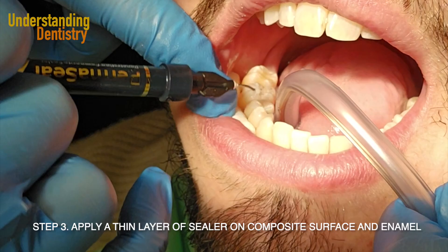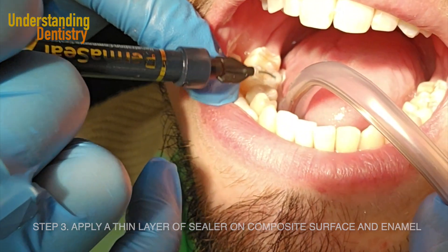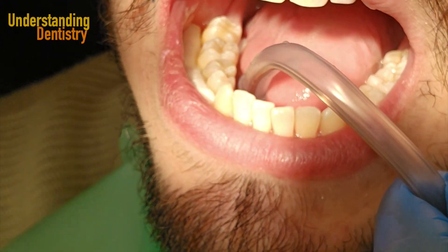Now we are going to apply the sealer — that's the Permaseal from Ultradent — and it actually seals the existing restorations.